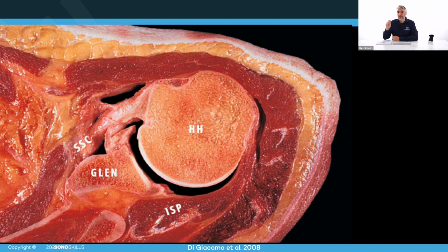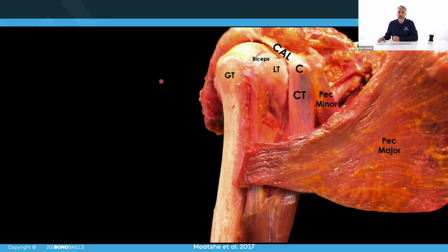We're going to follow the biceps to distal until we have a point that you can see the pectoralis major tendon. So this is the pectoralis major tendon, quite broad, comes from medial, and together with a different structure, the latissimus dorsi, they also stabilize the biceps tendon.